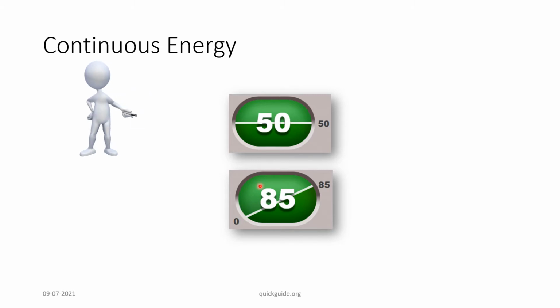However, note that both these are actually forms of continuous energy delivery. That is, the Phaco tip has no rest period. As long as you are in foot position 3, the Phaco tip will be traveling and delivering energy in a continuous fashion. That could be fixed, that could be linear, but the energy delivery inside the eye will be continuous.